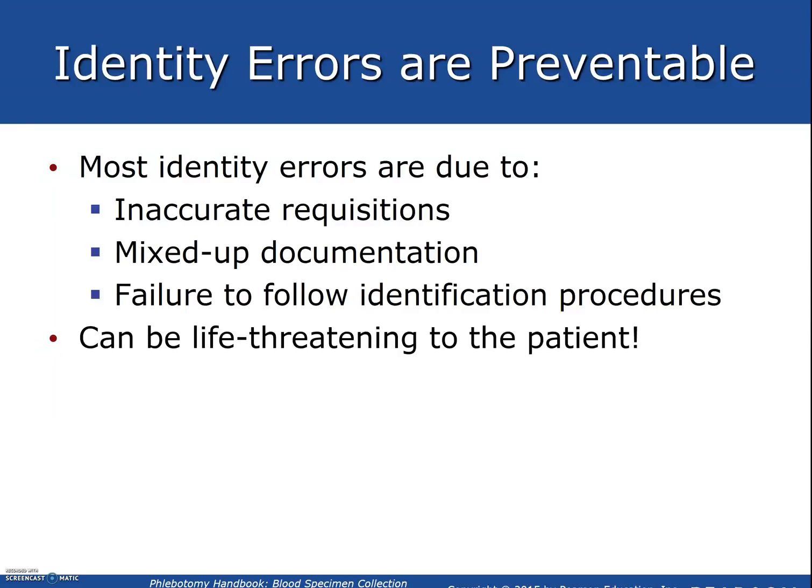If you draw the same patient day after day, we still need to go through that identification process of having the patient state their first and last name and date of birth. It seems very tedious, but we never know when patients change rooms, and we need to verify that we have the correct patient at all times.